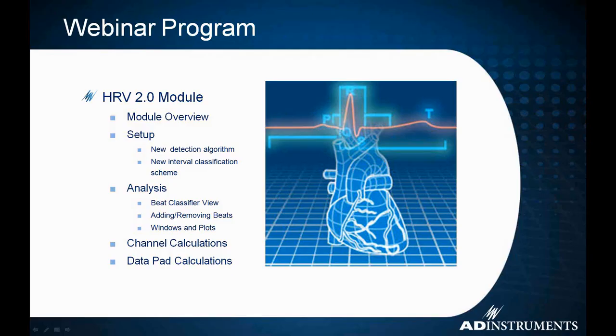So, HRV, what is it? What do we use it for? HRV analysis is a popular non-invasive tool for assessing cardiac health and, of course, the state of the autonomic nervous system. It is thought to reflect the heart's ability to adapt to changing circumstances, such as unpredictable stimuli, so hot, cold, stresses to an individual. And it's also really useful for investigating the interplay between the parasympathetic and sympathetic nervous systems and their controls on the heart.